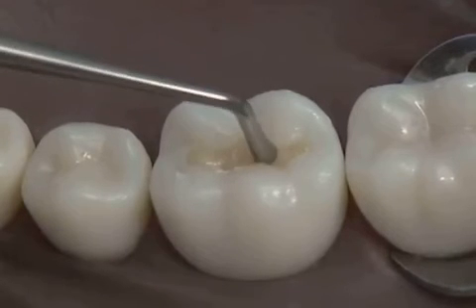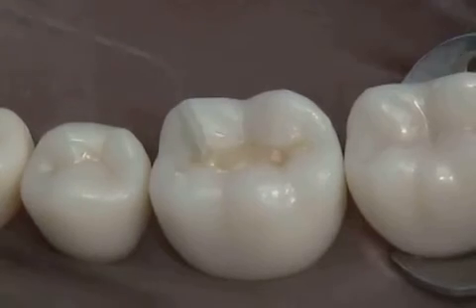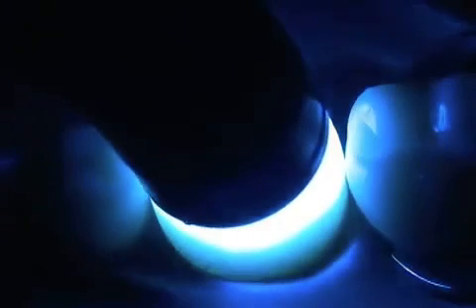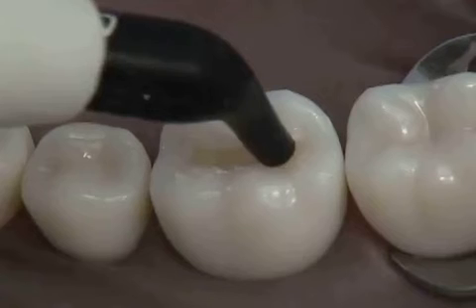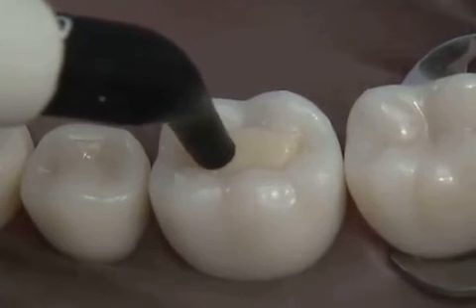You can wipe some adhesive on the end of the instrument to prevent it from sticking to the composite. Once this is completed, cure that layer for about 20 seconds, or as directed by the manufacturer. Continue this process until you have enough composite built up for a final layer.